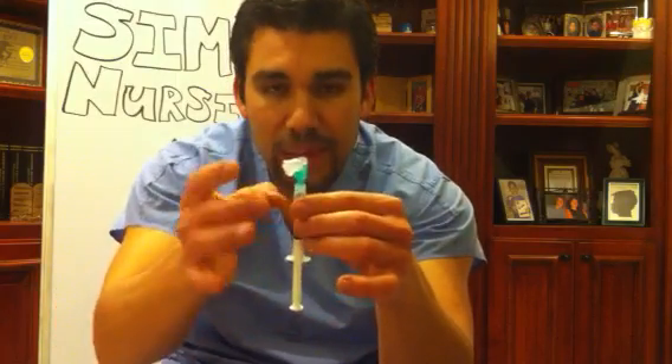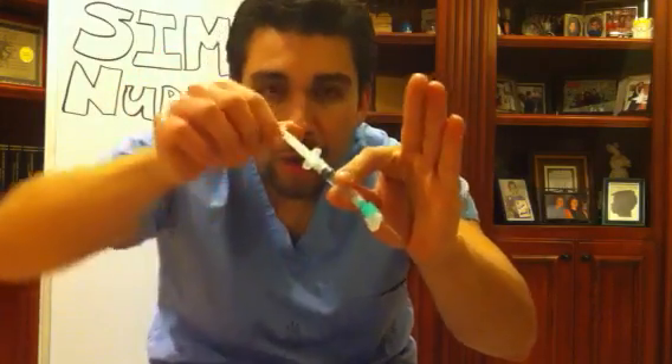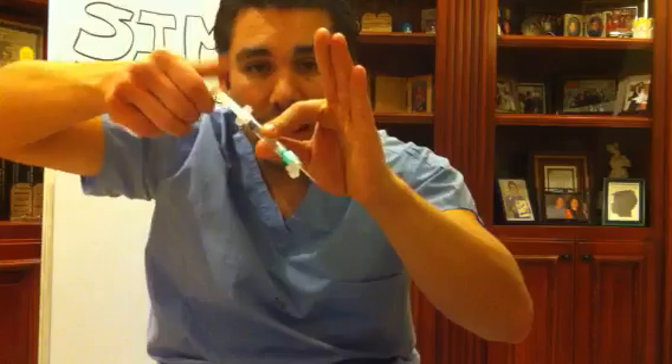Draw it up and make sure the bubbles come out the top. You want to bead your drug at the end of the needle. Make your landmark, swab with your alcohol prep from inside out. Using the Z-track method, pull the skin taut, hold the syringe like a dart, and stick it in. Grab the plunger and pull back — that's called aspirating — to make sure you're not in a blood vessel. Then push it all the way in.